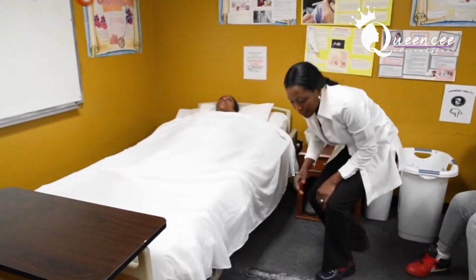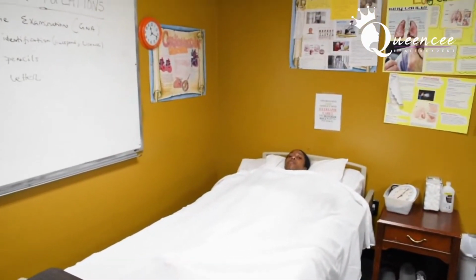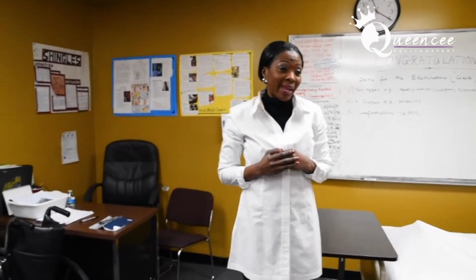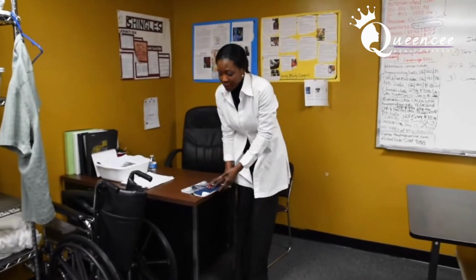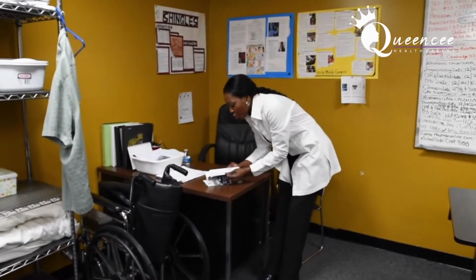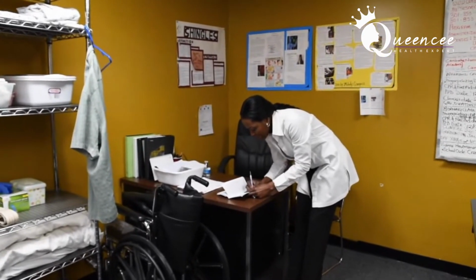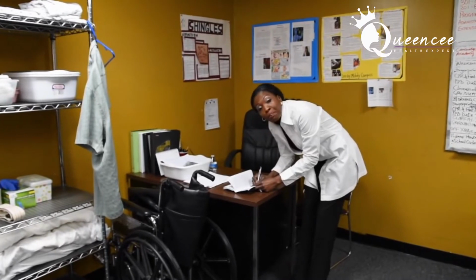Get rid of my equipment. Wash it. Yes. Tell the examiner you are going to what? Wash your hands before you record. Okay. It may seem like, oh, how am I gonna remember it? But unfortunately, we have to. Okay. So I tell the examiner I'm going to wash my hands, and under weight, I would put how much I got. LBS with the number that you got.